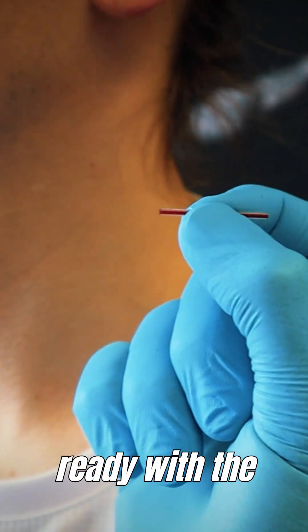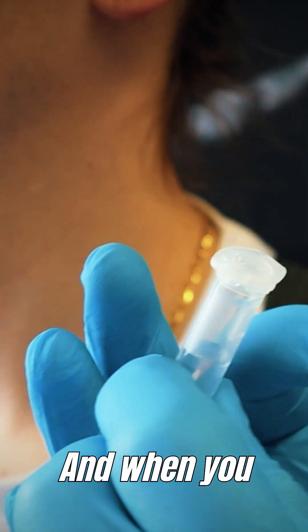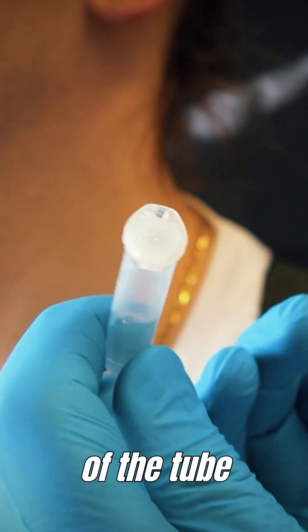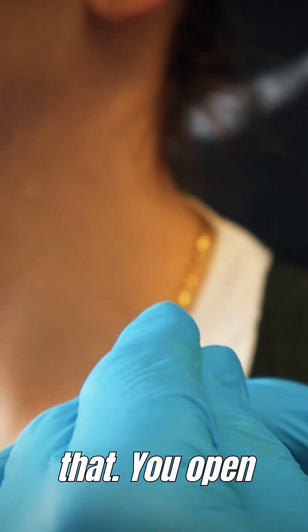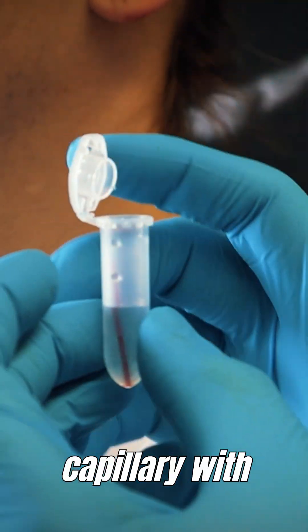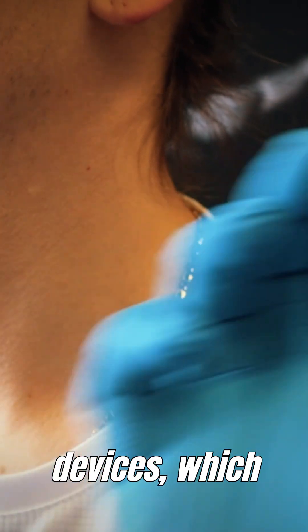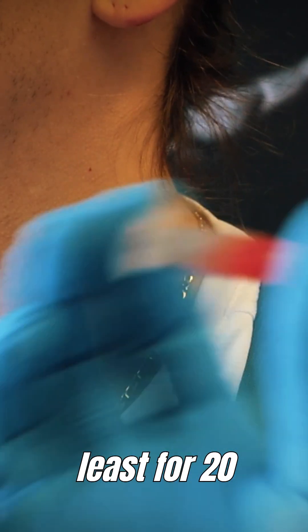Once you have your capillary ready with the blood, you need to insert it in one of these tubes. Before opening, ensure there is no liquid on the top end of the tube because it might spill out when you open it. Open it carefully, insert the capillary with the blood, close it, and shake it. There are professional shaking devices which are recommended, and if you don't have one, shake it for at least 20 seconds.